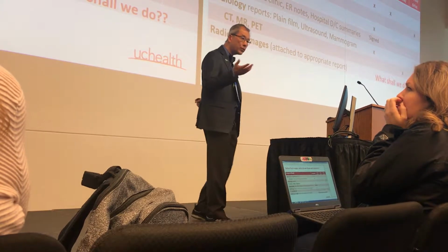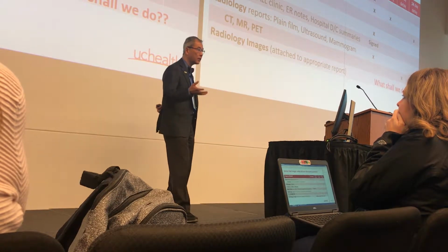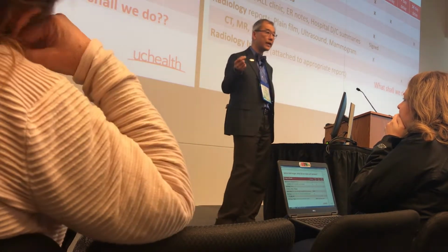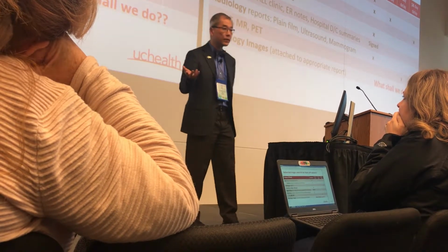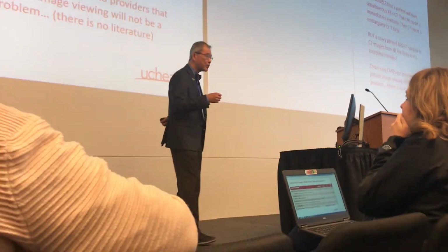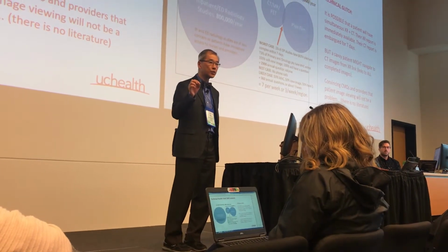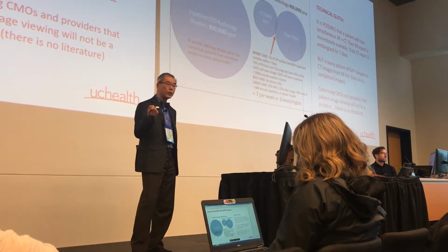And so the question is, what do we do with our radiology images? We noodled on that for a while until we struck on the duh. If we embed an image link, why don't we embed it on the radiology report that already has built-in delays? The ones that go out immediately, send a link with the immediate report. The ones that are delayed 7 days, send the link with the delayed report. Easy, right? Well, it turns out there is kind of a technical hurdle, which is that we think that some fraction of the time, patients will have simultaneous x-rays and complex imaging. Small gotcha there.